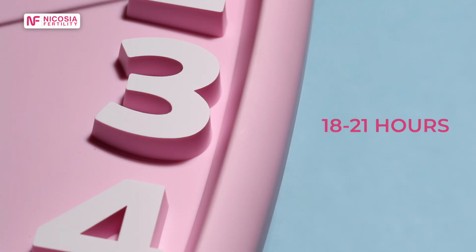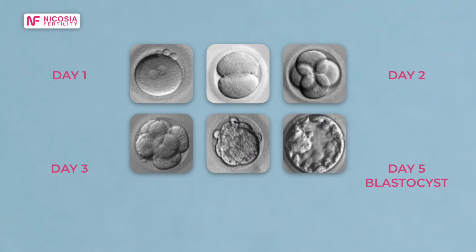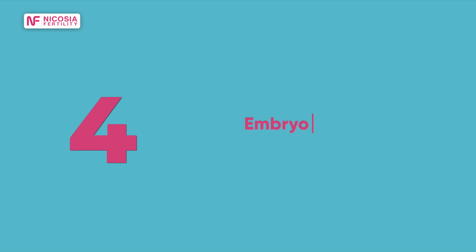Within 18 to 21 hours, we check for successful fertilization and continue to culture the embryos until they develop into blastocysts. This is an advanced stage of development that occurs about 5 days post-fertilization. Embryo transfer.